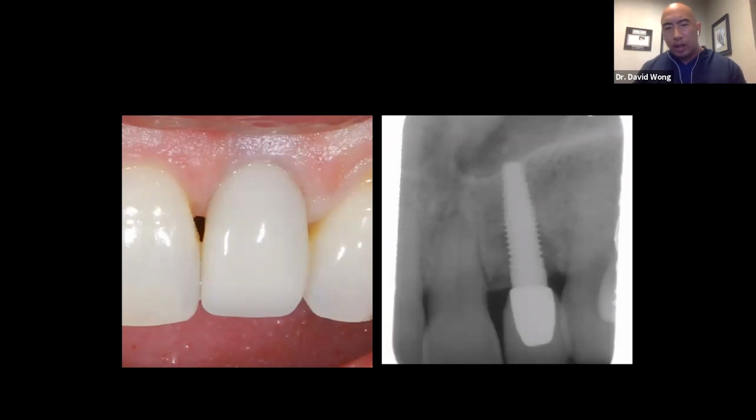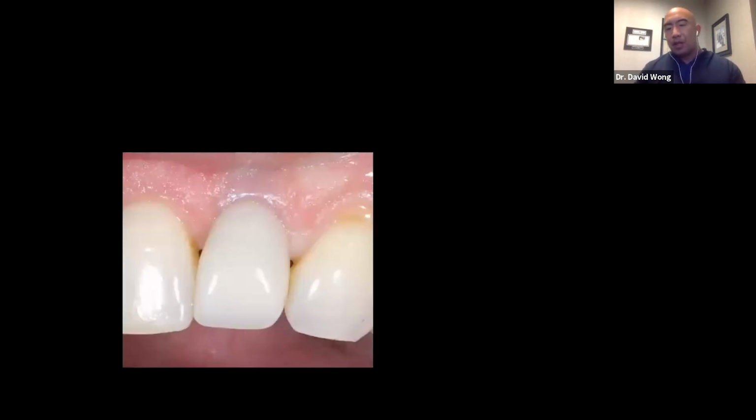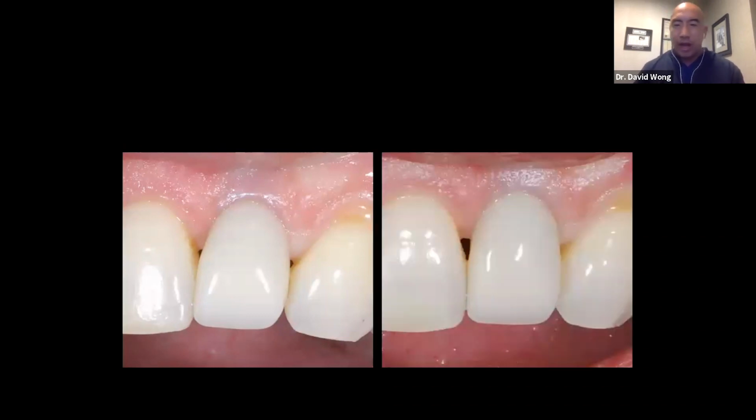Once again, when we look at the clinical result, things look pretty good. We got the stippling back. There's no clinical inflammation anymore. Radiographically, we got good bone fill. But if you look at the papilla, I'm going to show you this. This is the before, and you can see that shiny, erythematous, edematous facial marginal gingiva. Now it's better. The facial gingiva does not change a whole lot, but look what happens interproximally, where we added the bone.